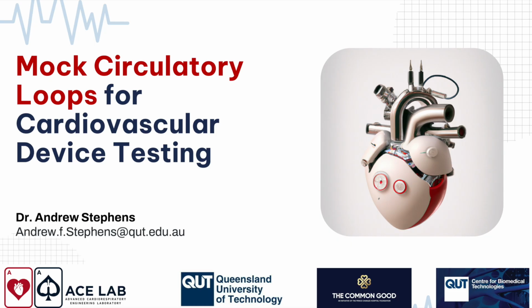Some final thoughts on actually the physical putting together of the mock loop. Depending on the complexity, you may need pressure sensors, flow sensors, volume sensors, which you can see here: pressure, flow, volume. Your mock loop may need a brain if you want to do those calculations like we saw in the Frank-Starling mechanism. You will need something to read in the values, something to do the calculations, and then output to your actuators to impose that calculation on the mock loop.